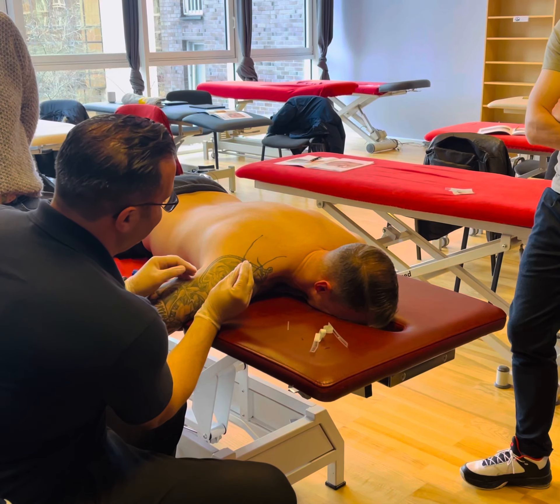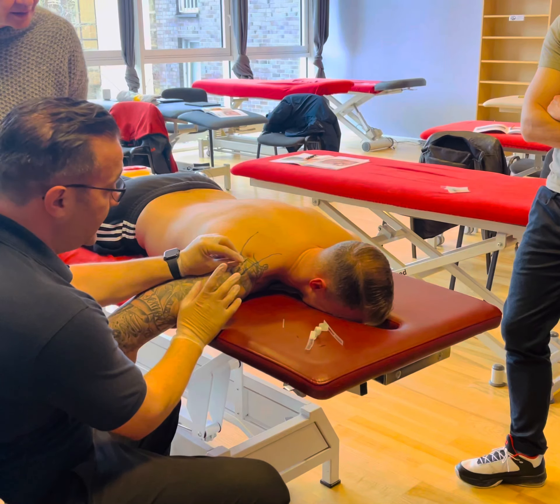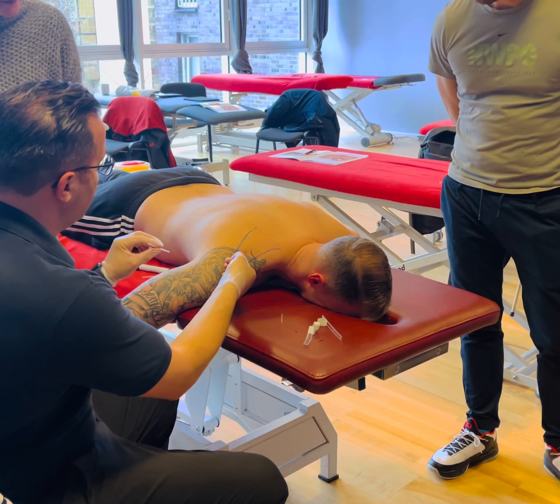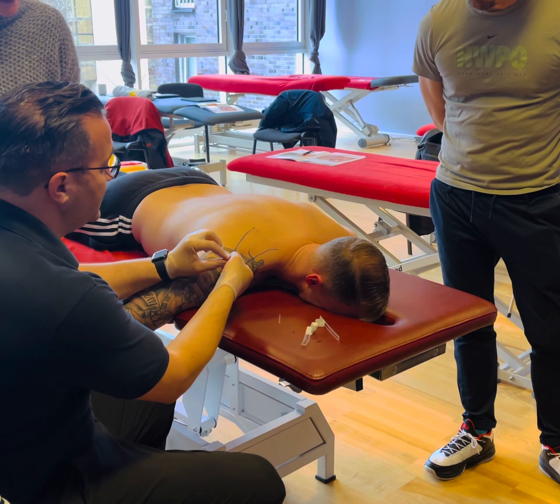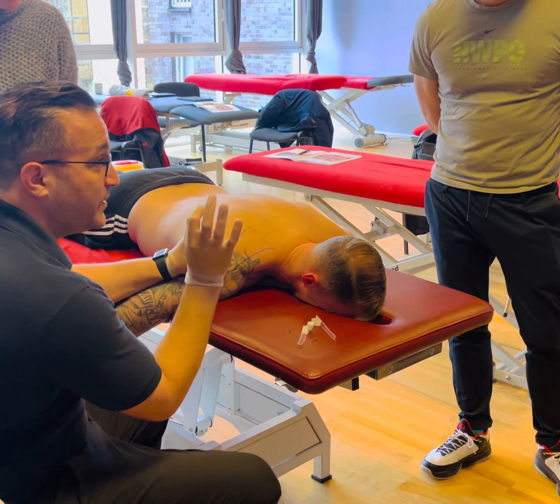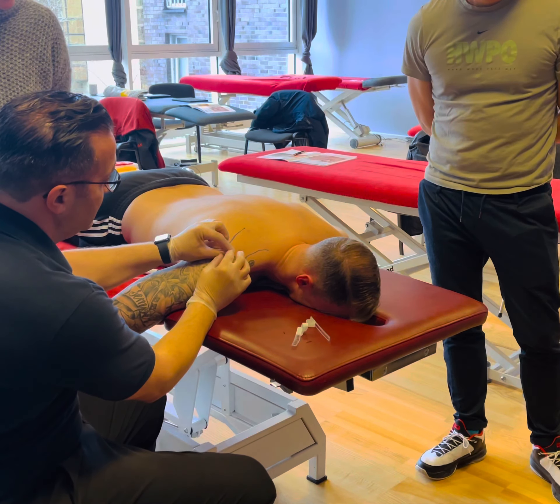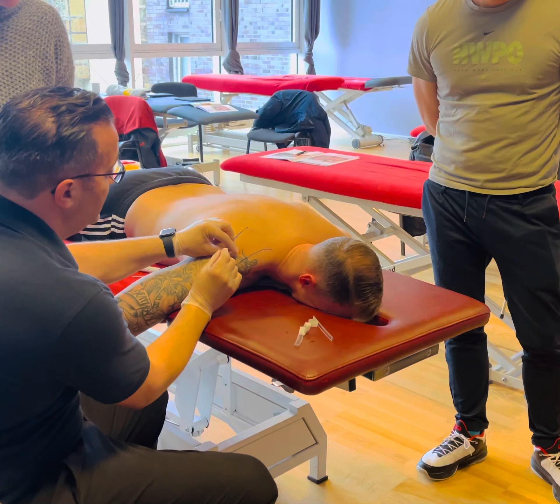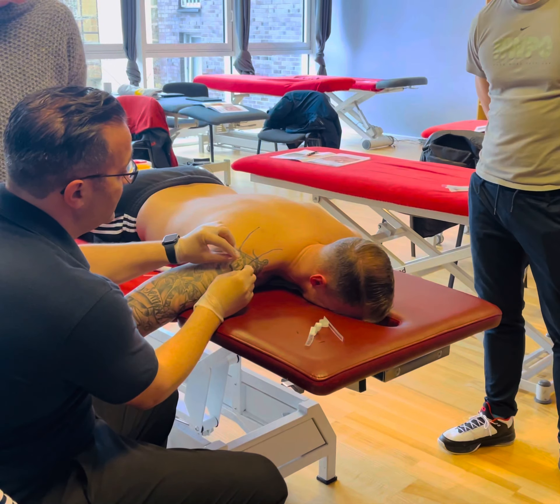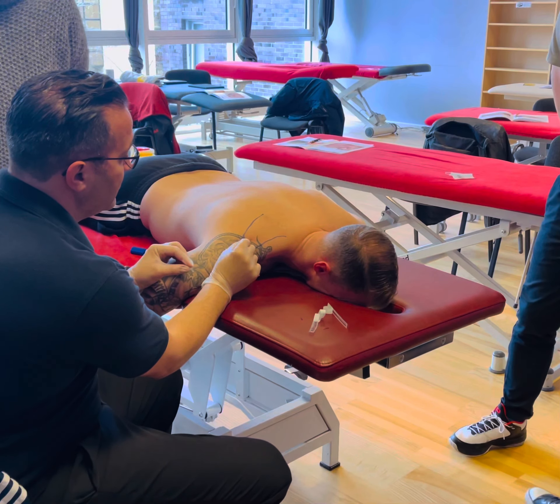Long enough? Same technique, but now look — the longer the needle starts to bend, this is why we have a trick. Smaller guide tube — this is where you make sure you've had your eyes tested. Thread — that stabilizes the needle and then gives it some support and then you can thread through.